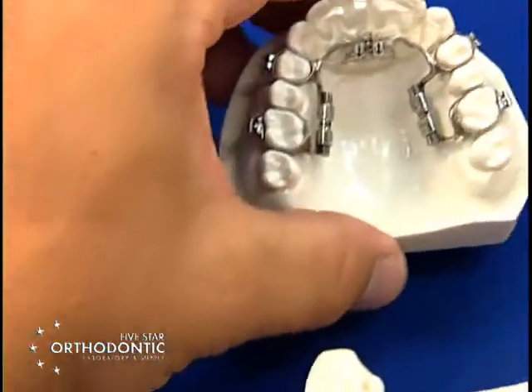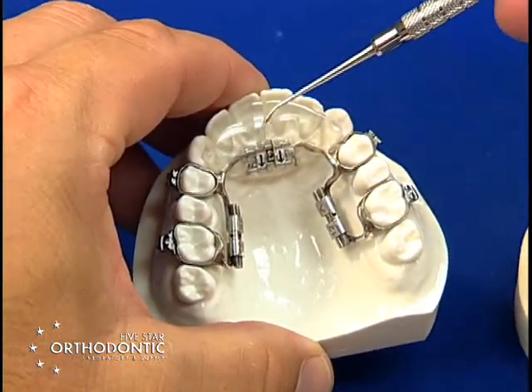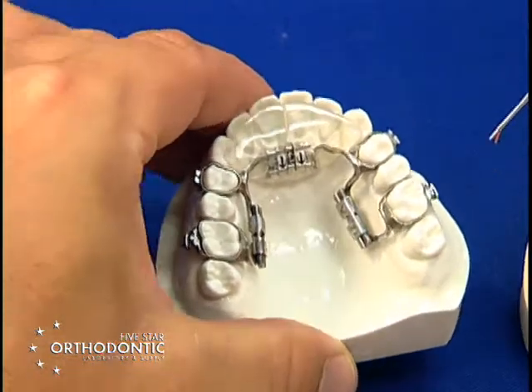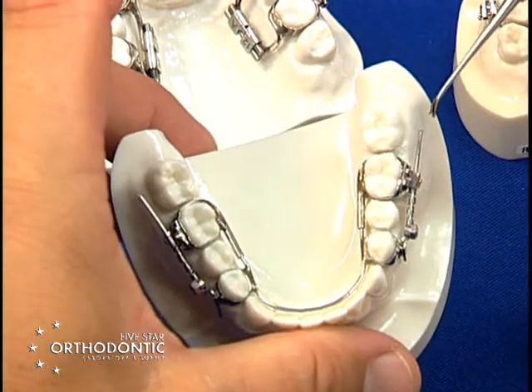You have a barrel fixed three-way which will distal drive molars and widen the arch transversely. You also have CD distalizers that are used to distal drive molars.